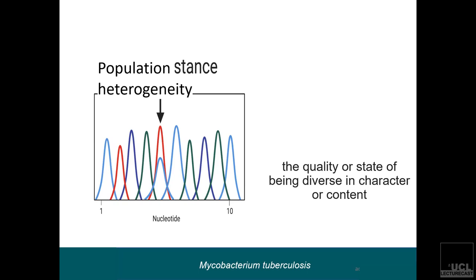Now, TB can take up to 42 days before it becomes positive. So with these sequencing techniques, things are moving on. It has been demonstrated by Lindsay that you can sequence directly from sputum and the like. It's still being perfected to be made better, but I think that's where we are heading.